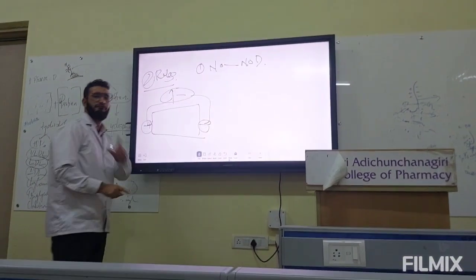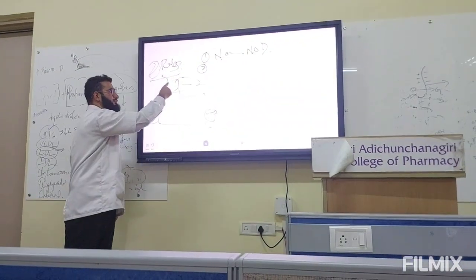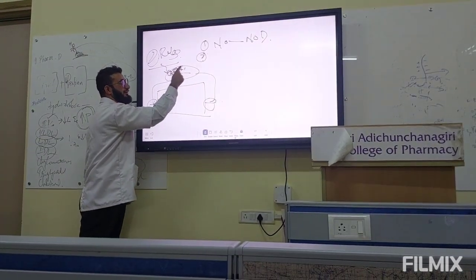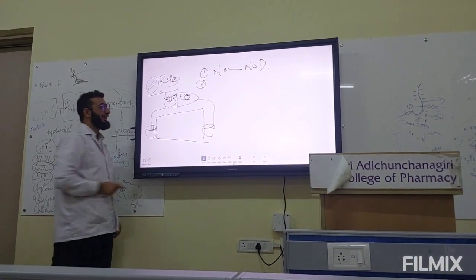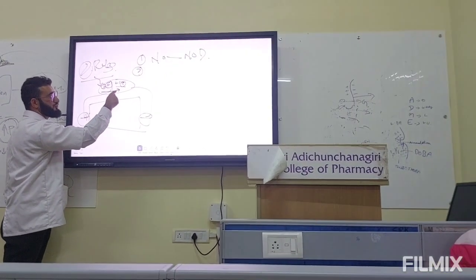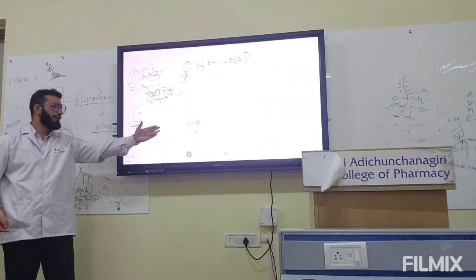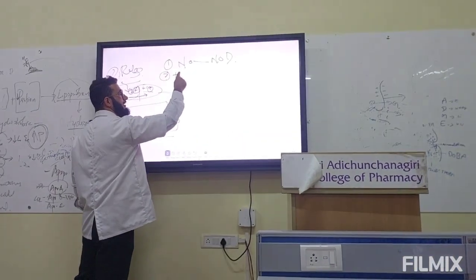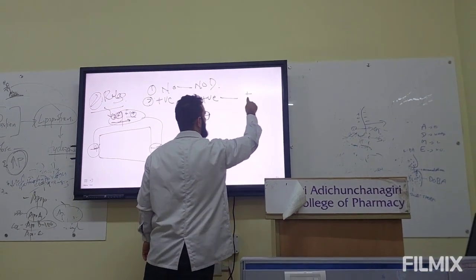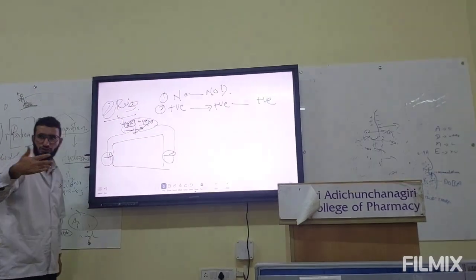No deflection. Okay. First rule, number first. Rule number second. See, when there is an appropriate stimulus from the SA node, it will depolarize the tissues like this, and the direction of the current is like this, from positive terminal to negative terminal, or from negative terminal to positive. When the direction of positive current is towards the positive end of the electrode, deflection is positive. So the galvanometer is going to deflect to the positive side.